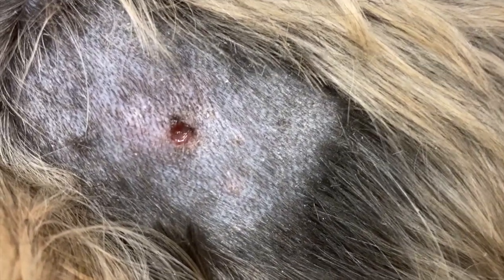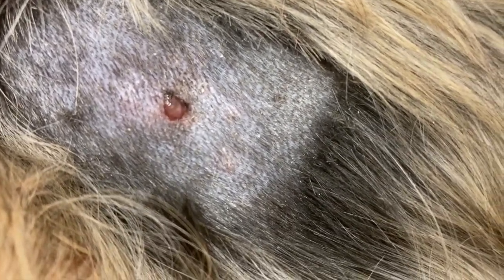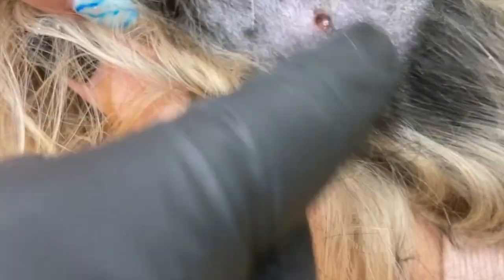Okay guys, you can see a whole bunch of red inflammation surrounding the botfly. The cuterebrae is actually really easy to see. If you look in the middle, you can see it's kind of wet right there, but it slides up to breathe and then back down again. That's his little mouth taking a big gulp of air.